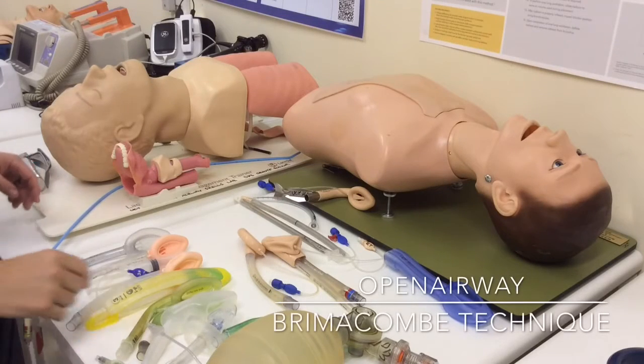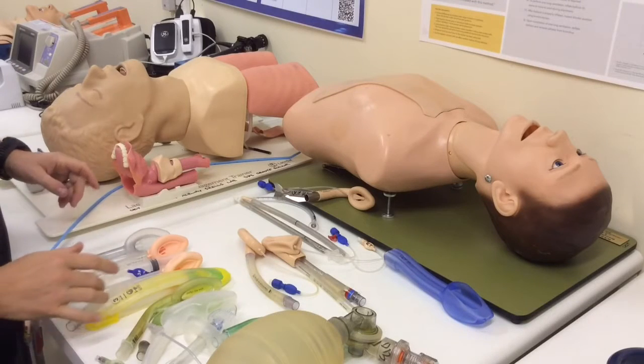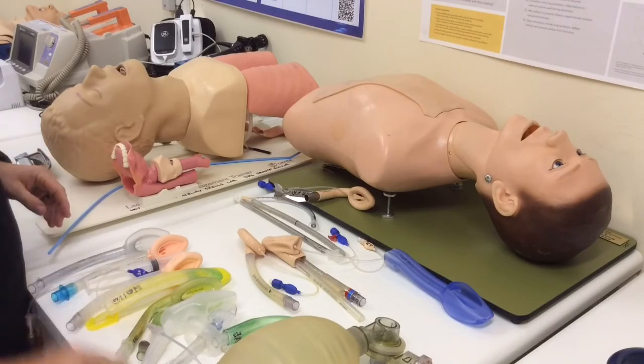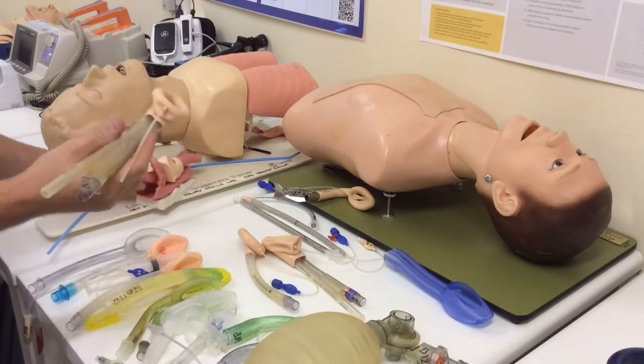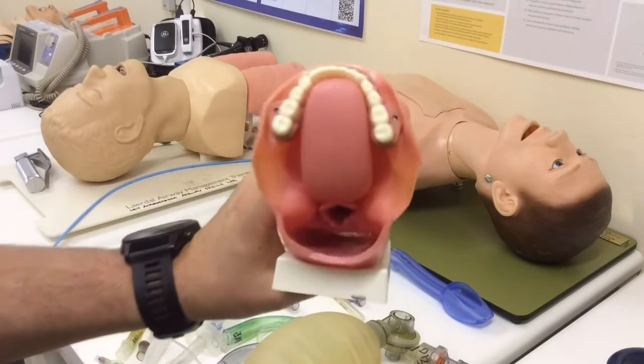Hey folks, Ross here from Open Airway, currently in the UCT Anesthesia Airway Skills Lab. I want to talk quickly about a technique which aids you in placing some of your supraglottic airways that have a drainage tube, classically described by Brimacombe using the ProSeal LMA.